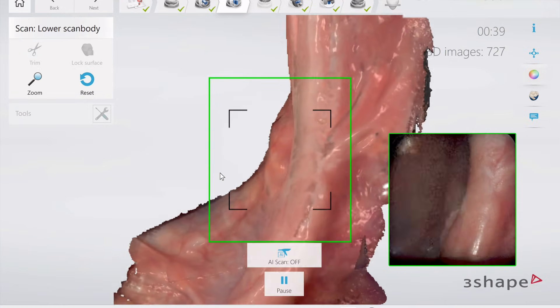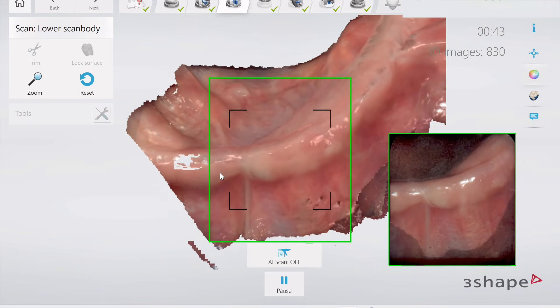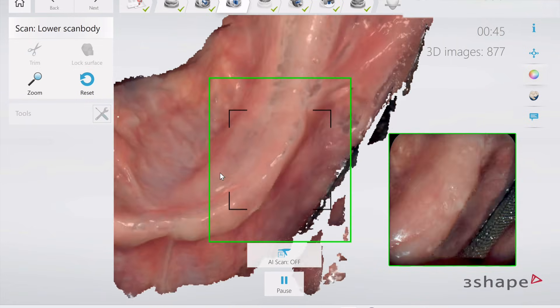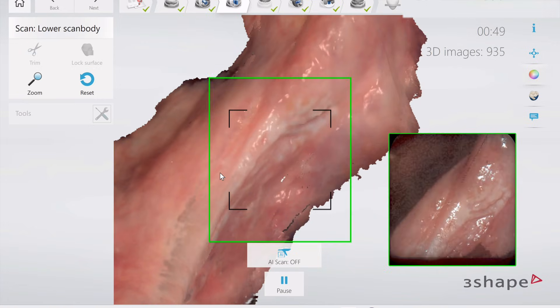Even that buccal frenum — that labial frenum has not moved right there. And that's what's key, because once you have movement, it's the kiss of death for stitching these images together, and then you get things like lightning bolts and folds upon folds.